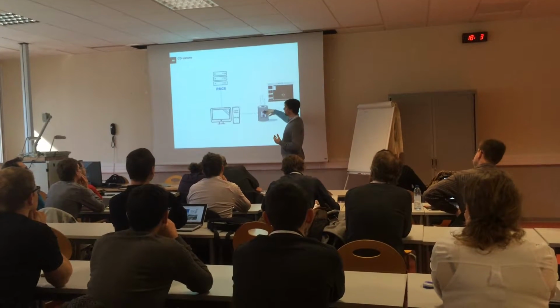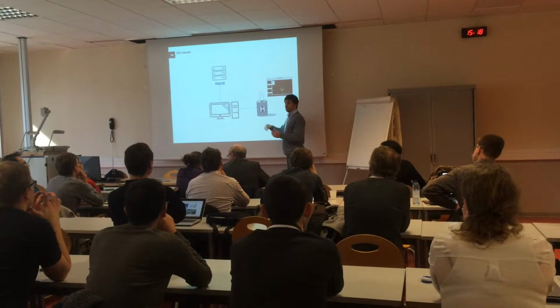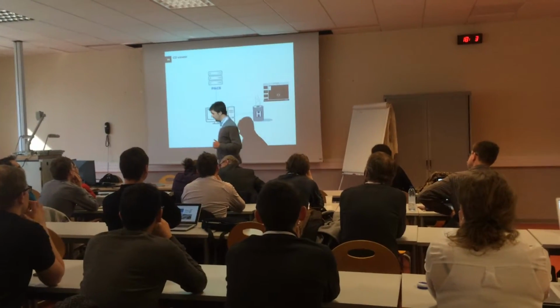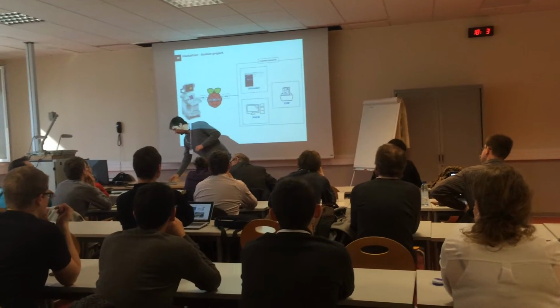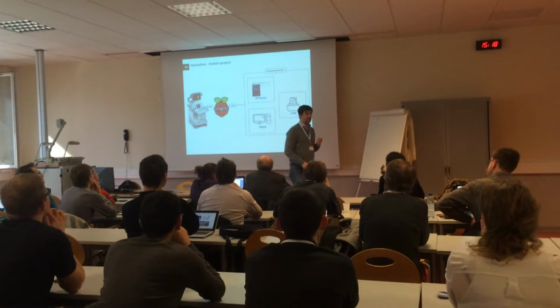And there's a viewer, the viewer that I showed you, that is installed on the CD. You just enter the CD in your PC, and then it fires off the study. This is a case that we're presenting tonight for the hackathon.